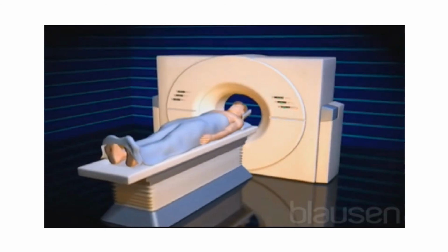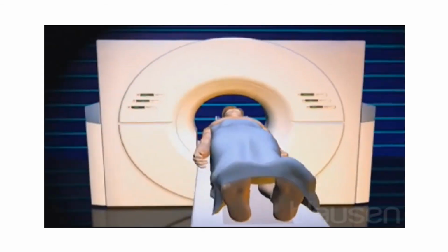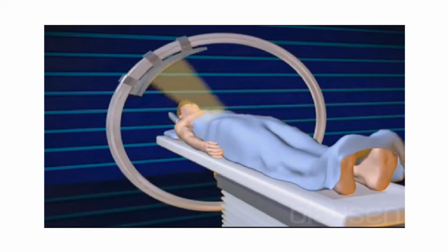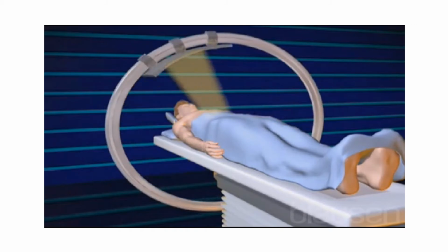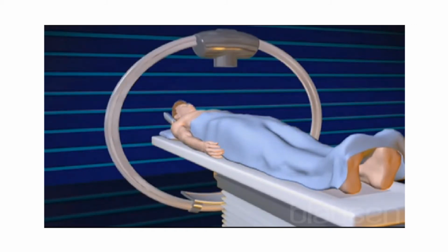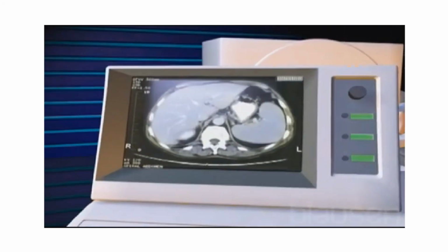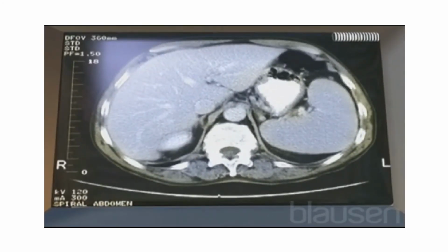While X-rays are limited to two-dimensional renderings, CAT scans are able to generate 3D views by rotating a conventional X-ray beam in a spiral around the patient's body. This series of rotations around the body creates image slices. A computer gathers, compiles, and translates these images into a 360-degree view of a targeted area, or even the entire body.